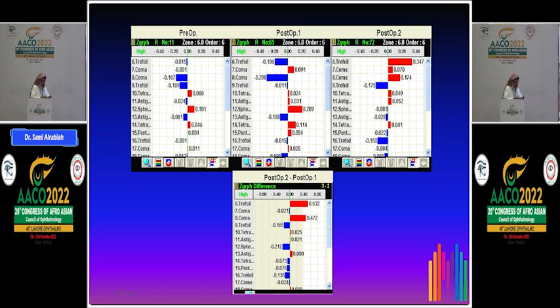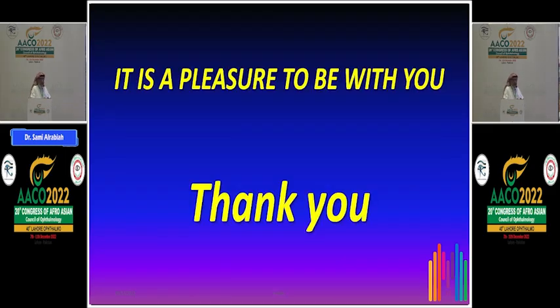Look here, number 12. Spherical aberration getting higher, and now here, look at the difference. So really, the bioptic technique gives you another chance to correct whatever residual there is without jeopardizing the quality or safety, and then correct any problem you induce to that patient. Thank you very much.